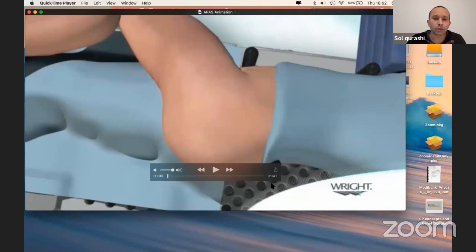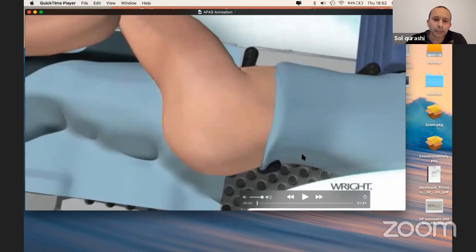All right, so in terms of patient positioning, it's positioned like a posterior approach, lateral decubitus position. We don't use the brackets on the front and back of the patient. We have this thing called a peg table. It's just like a little sheet that goes on top of your normal table and then jelly on top of it. And we just put a post front and back and another one front and back of the chest. So positioning wise, you can use the brace as well, the normal posterior brace that you use, if you want.